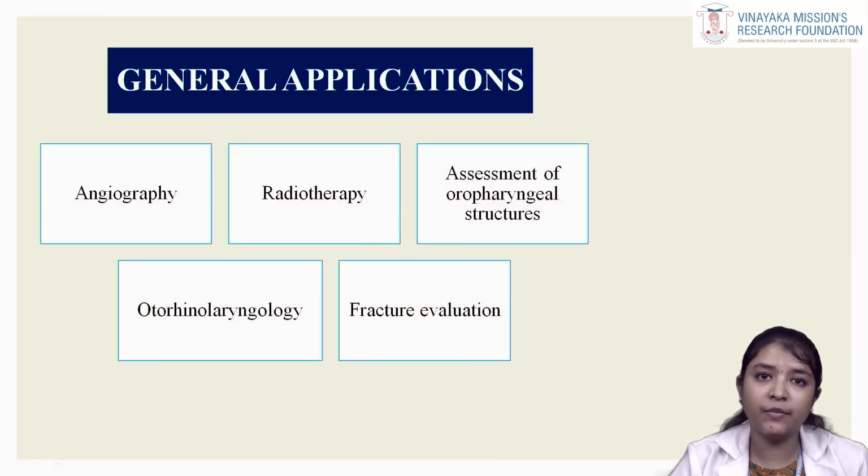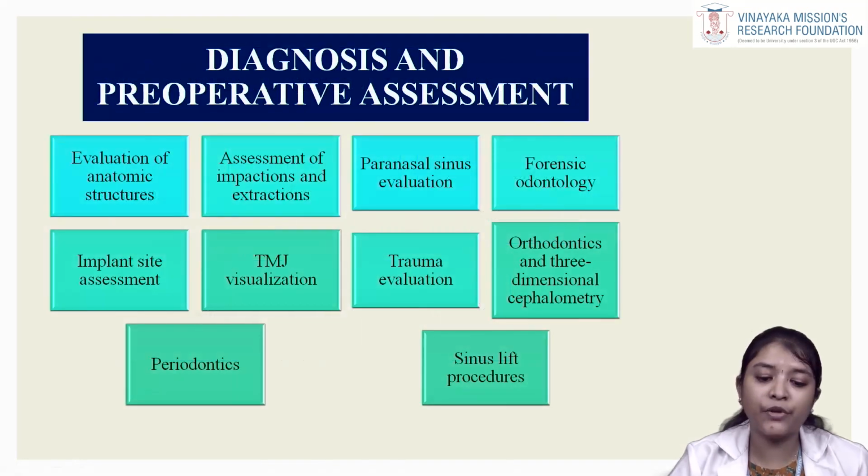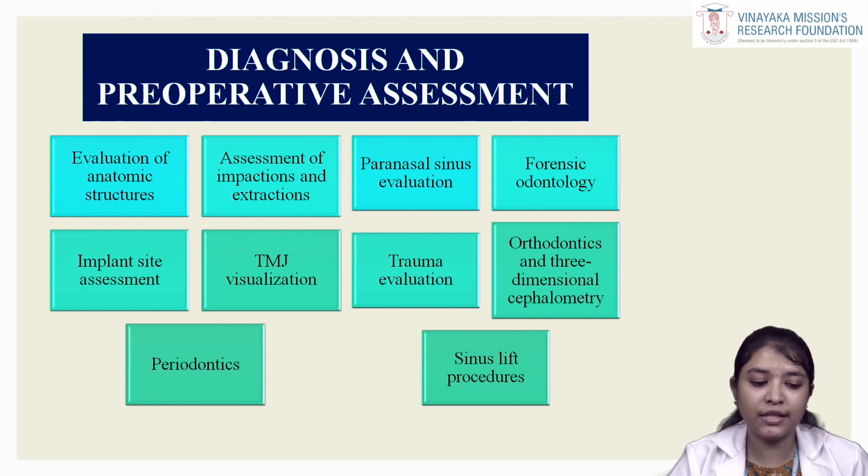General applications of CBCT, as I said before: initially it was used in angiography, then radiotherapy, assessment of oropharyngeal structures, otorhinolaryngology, and fracture evaluation. Diagnosis and pre-operative assessment is where our specialty comes in, where we can use the CBCT.